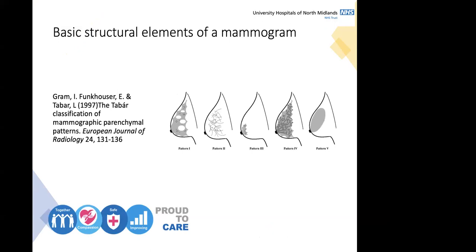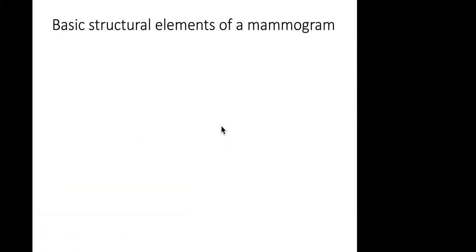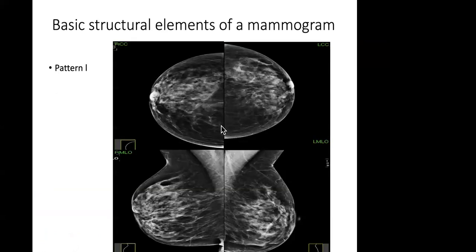This shows different patterns of mammograms. The one in the middle shows a very fatty mammogram — you can see through it and it would be easy to pick up an abnormality. Then you have a pattern that is very very dense, and it would be very tricky to pick up small changes. Then there are those with mixed tissue — glandular tissue, fatty tissue, and vessels going around the breast. It's just about knowing those structures so that when identifying abnormalities you're able to differentiate.